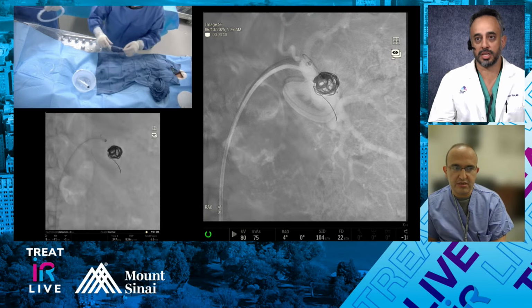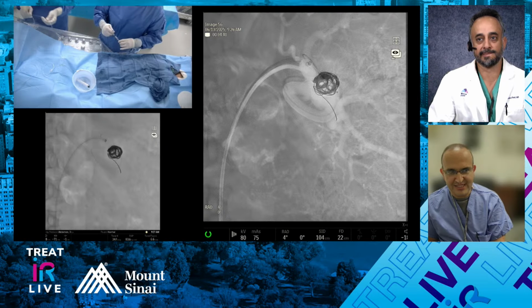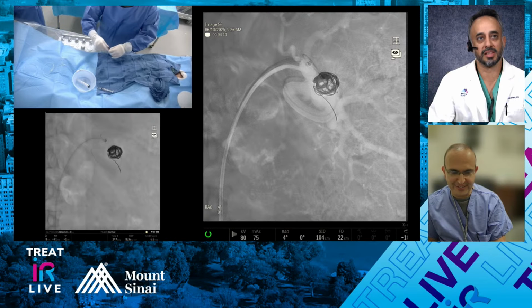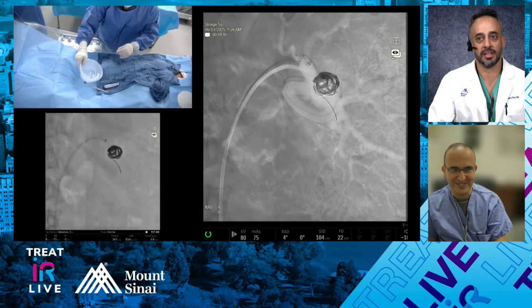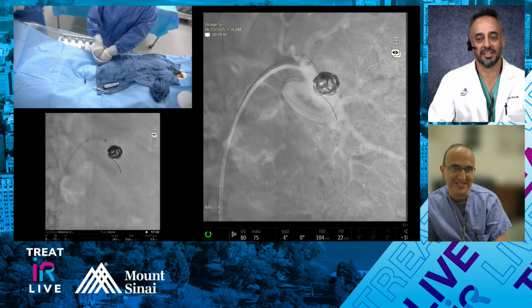I don't know. Have you used liquids? No, exactly, just like you said too. As Ed knows, I'm a little bit impatient too. So when you put in coils and you get near the end, as long as I feel like it's not going to go distal, then I'll start using a little bit of gel foam or glue to shut it down.